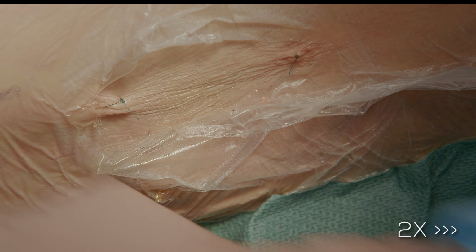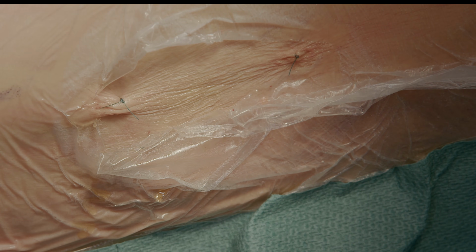Finally, the wounds are covered with wound dressings. And after the operation, full weight bearing is usually allowed. In other words, a hip fracture should be operated on and fixed in a way that allows immediate weight bearing if possible. Regarding recovery, it is of vital importance that an elderly hip fracture patient can be mobilized immediately after the operation.